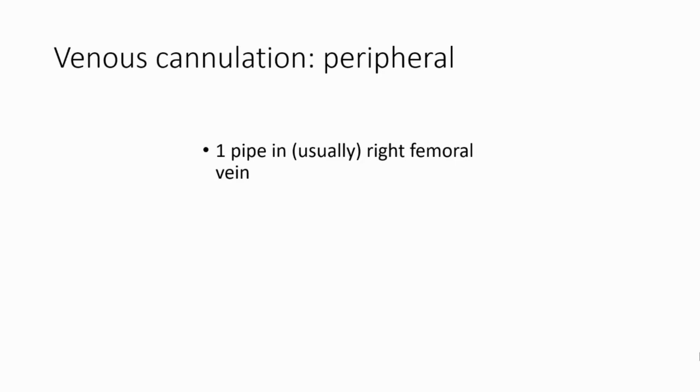Okay, so the second situation wherein you may use a peripheral cannulation strategy is in a patient who is coming for a second operation. And when this happens, you have to remember the patient's already had an operation. So the gap between the sternum and the tissues underneath, the pericardium, the heart, etc., that space can get full of adhesions, and it can be very difficult to open that safely.